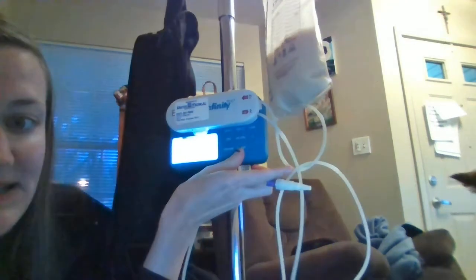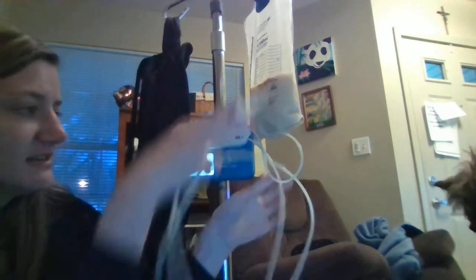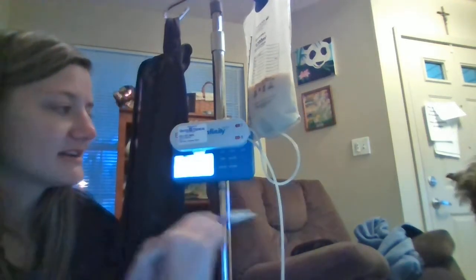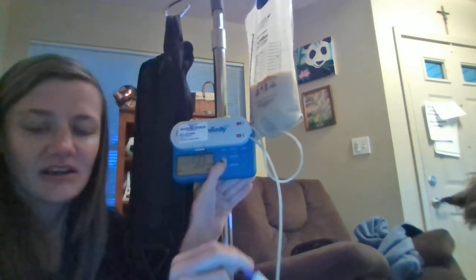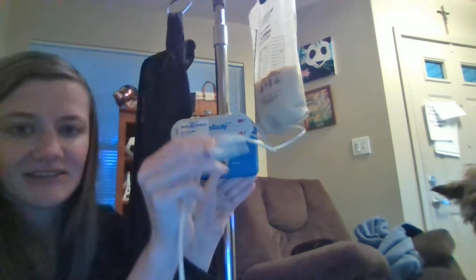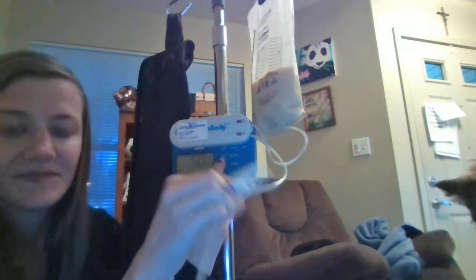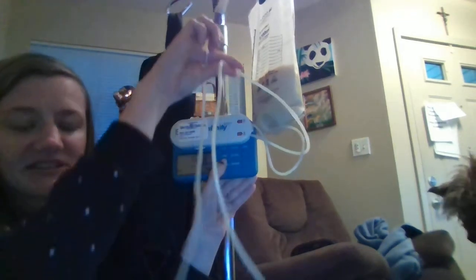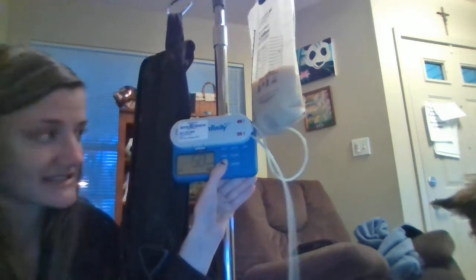You may not be able to see it, but it's already primed. So that means I don't have to worry about that. But if I were to prime it, I would press this button right here. Now you can see the 50. And you would hold it down for as long as it takes to get the air out of this line. There's no air in it right now because it's already been used earlier today. But anyways, you get what I mean. You prime all the air out of this line to where there's absolutely no air at all, because it's not good going in your small intestine.